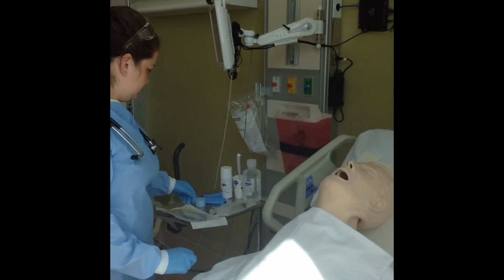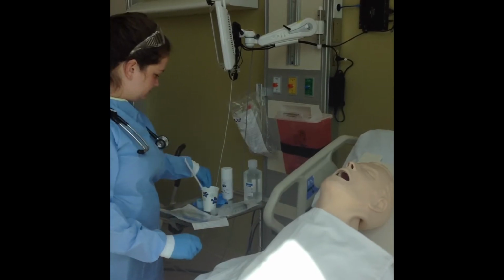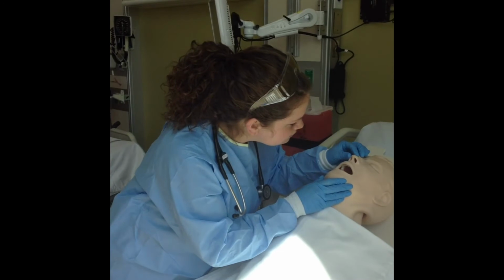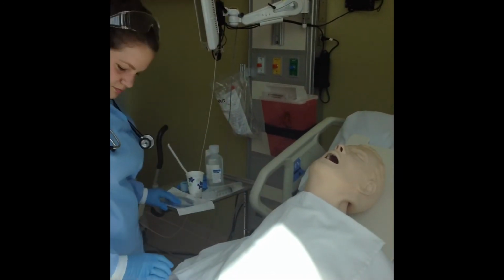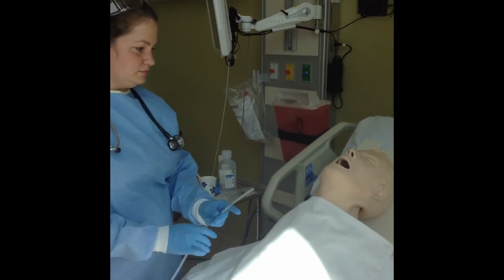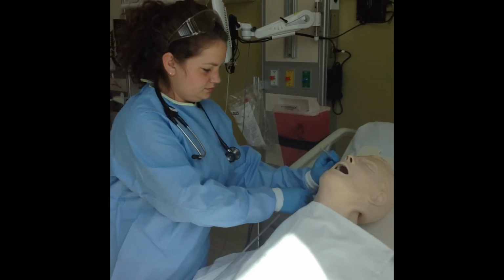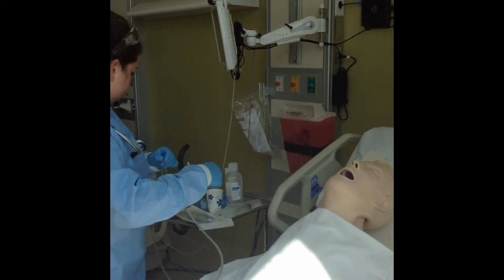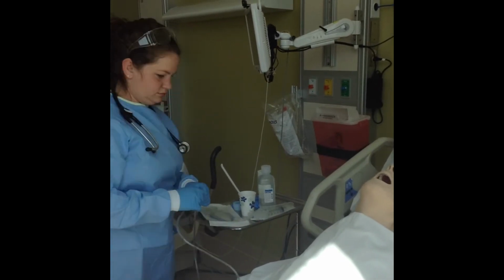Check for nasal patency and examine each nasal passageway. Choose the most patent nostril for tube placement. Then, using the tube to be inserted, measure from the tip of the nose to the earlobe, from the earlobe to the xiphoid, to determine the appropriate tube insertion length and distance. Be sure to mark the tube.